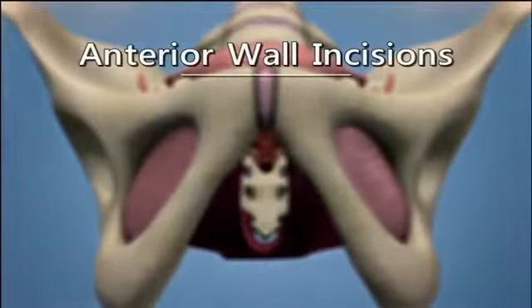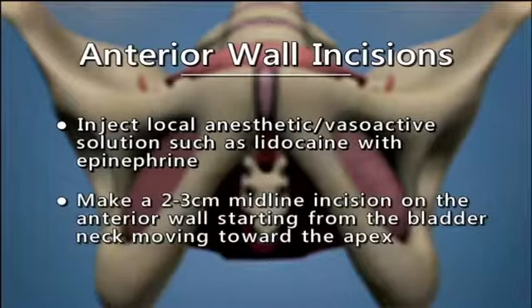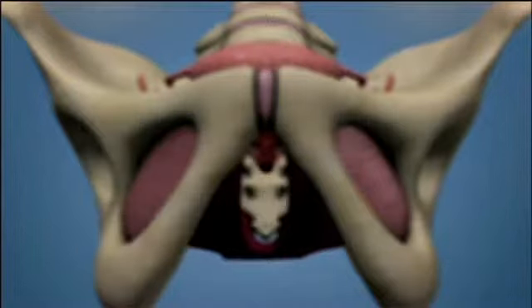Anterior wall incision. Inject a local anesthetic, vasoactive solution such as lidocaine with epinephrine. Make a 2 to 3 centimeter midline incision on anterior wall, starting from bladder neck, moving toward the apex.